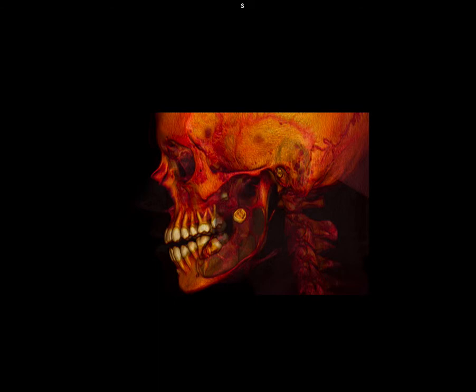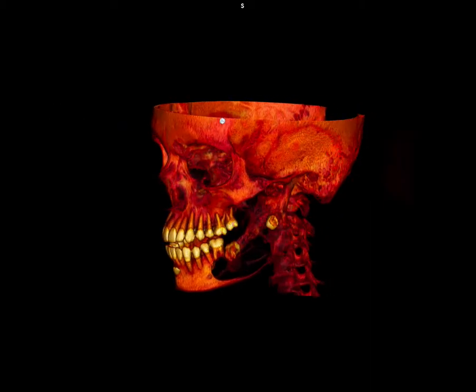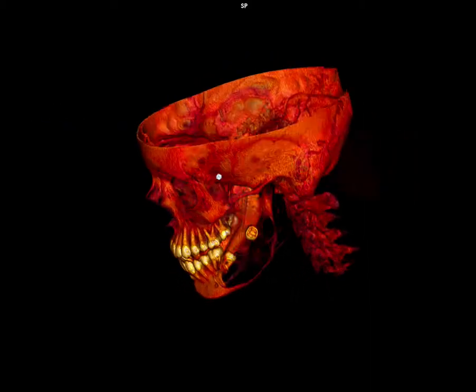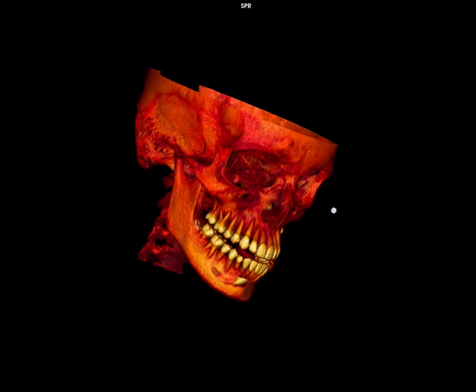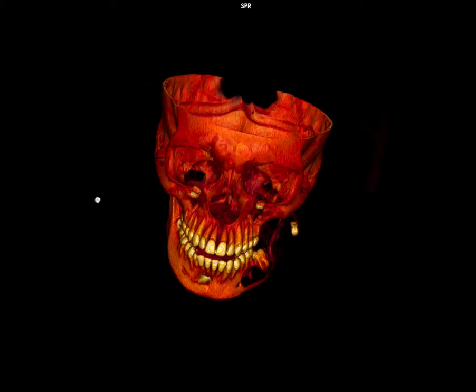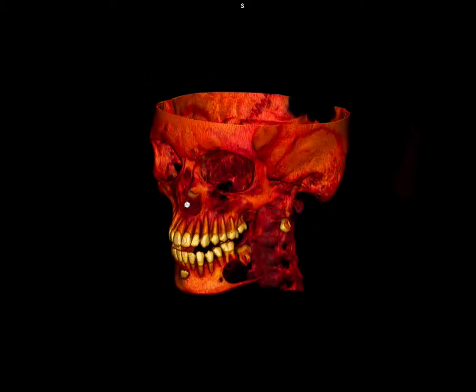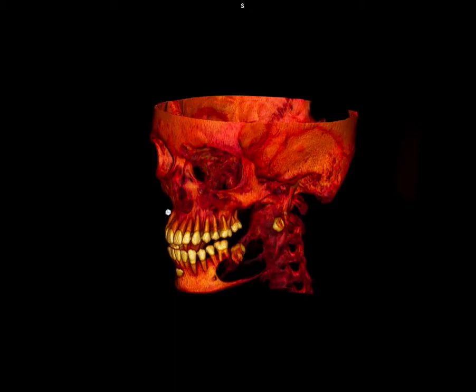Some areas of cortical bridging are noted. 3D images showing the lesion extent and few septations within the lesion. Comparing with the normal right mandible, based on these findings a radiological diagnosis of ameloblastoma was made and it was pathologically proven.